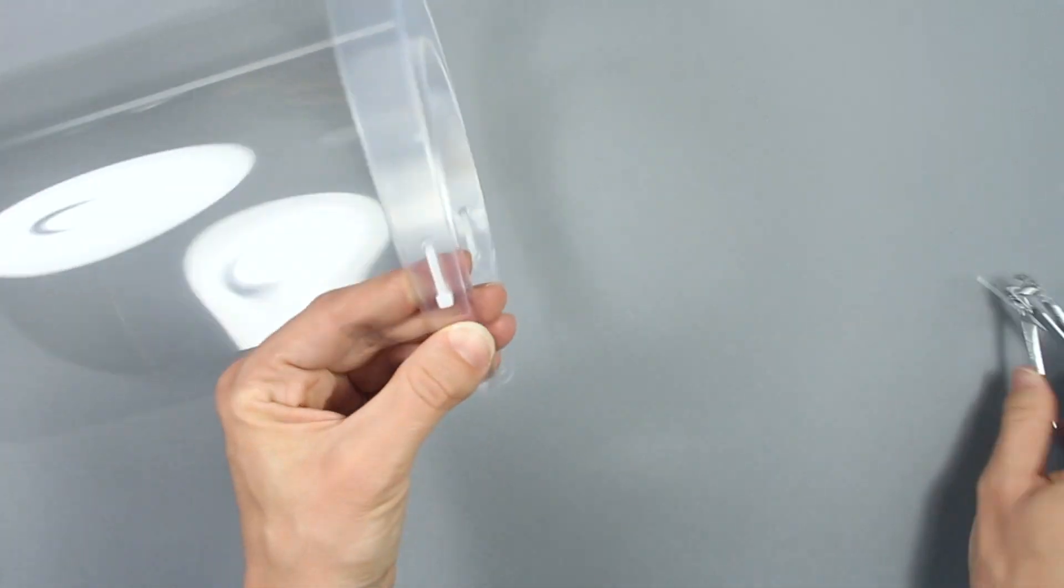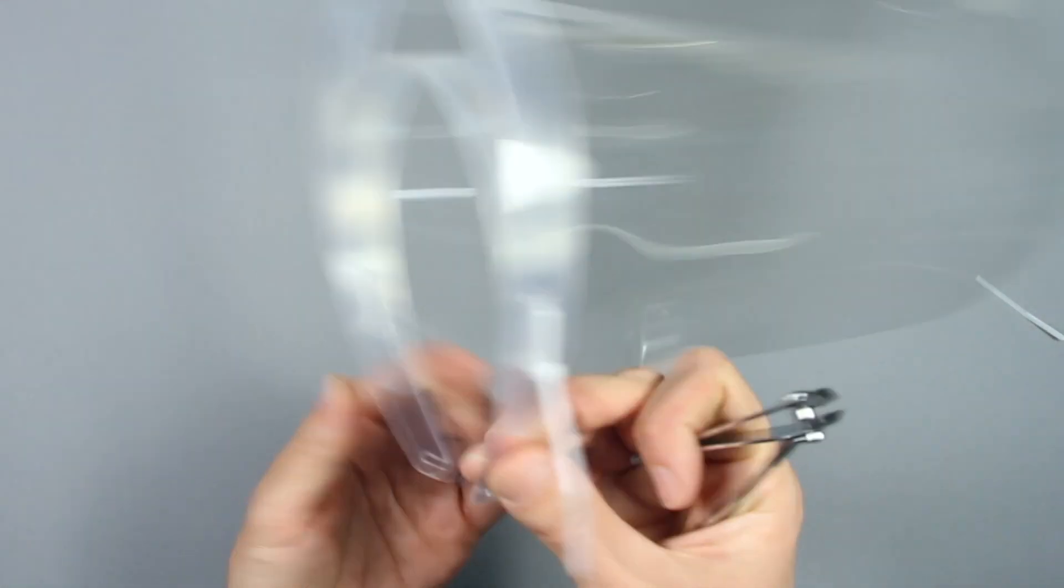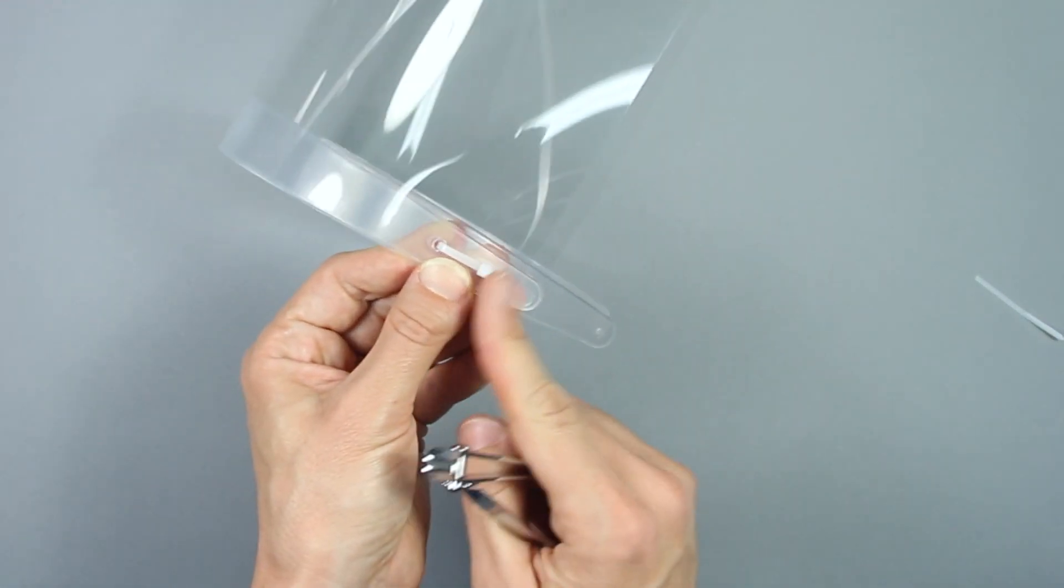Using a nail clipper, trim off the excess. This will create a rounded edge that isn't sharp.